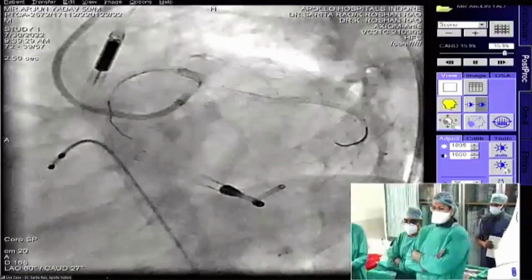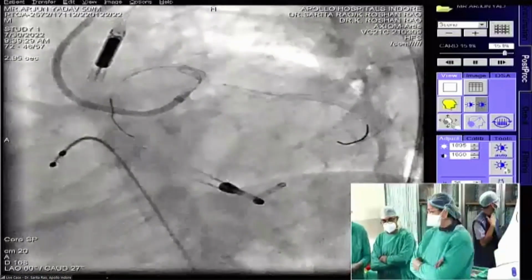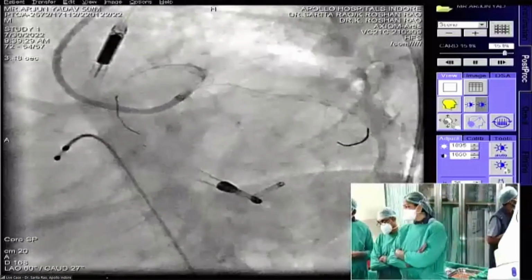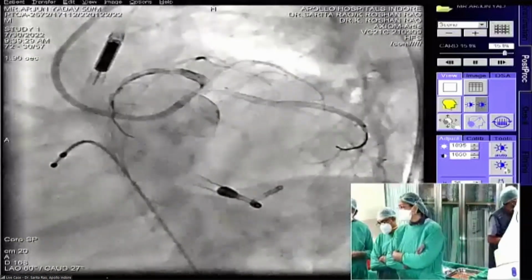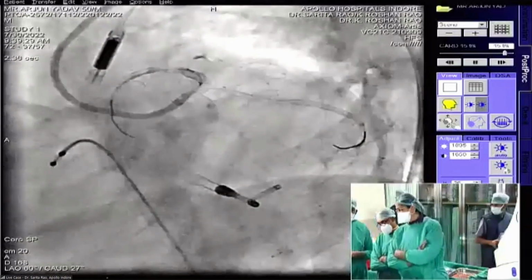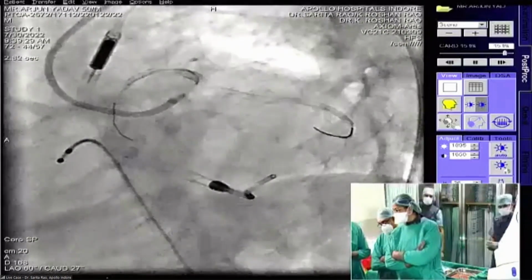Okay. Yes, your point about the left main, maybe I can go up with a 4.5. But let me just look at the area. Raj, can you tell me how much the left main diameter measured on OCT? On the OCT, it's 7.9. Okay. Diameter, I think probably it'll take a little bigger balloon because it looks a little less.